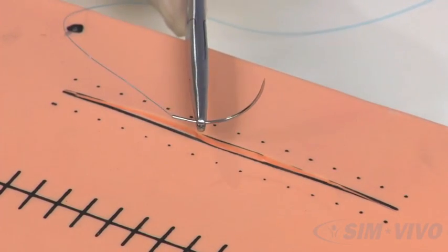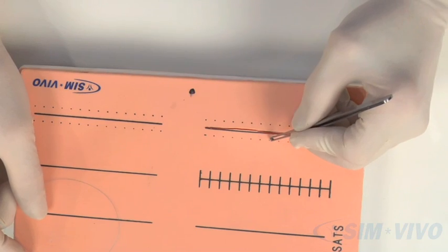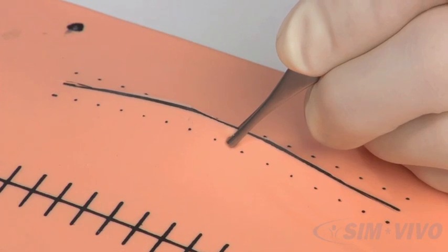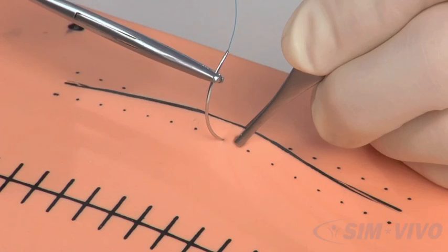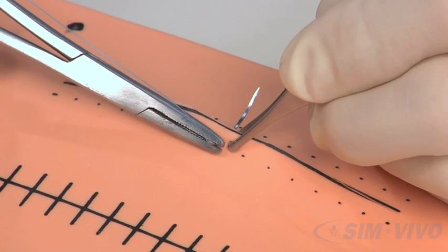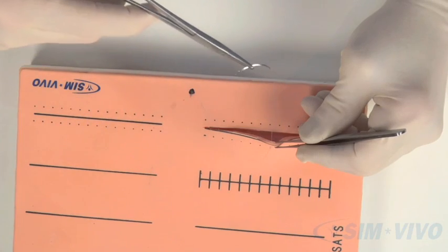Now, load the needle into the needle holder. The needle should be perpendicular at the end. Pick a dot in the middle of the line. Use the Adson forceps in your non-dominant hand. Hold them like a pencil. Pick up the skin to the left of the dot and engage the skin. Push the needle through and note that it is coming through. Disengage the needle, pronate your hand, re-grasp the needle, and pull it through, leaving 5 centimeters of suture.